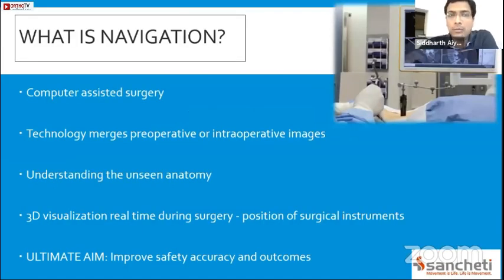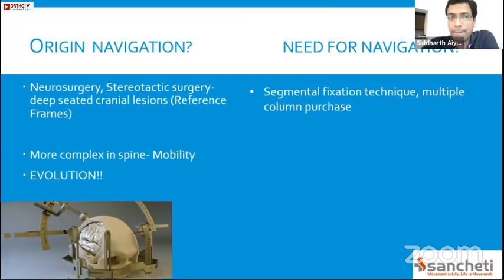So in one slide, what is navigation? It's a computer assisted surgery. It's a technology that merges preoperative imaging with intraoperative imaging so that you can see unseen anatomy. All this helps you to 3D visualize in real time during surgery where the screw is going, how your instruments are going, with the ultimate aim to improve the safety and accuracy.